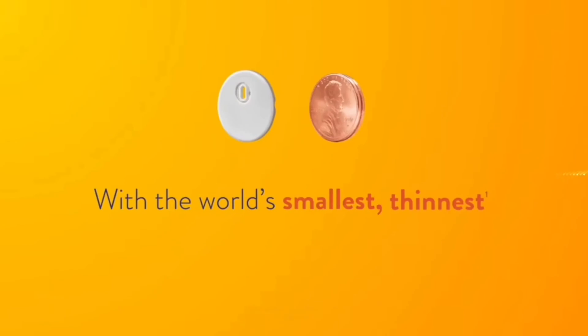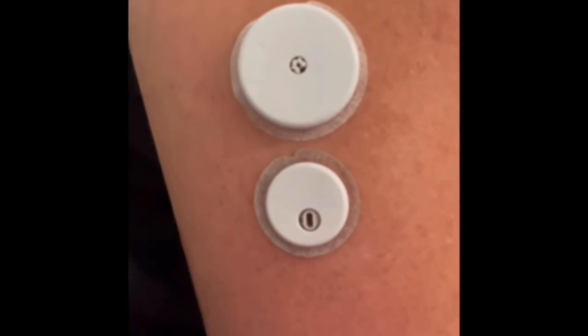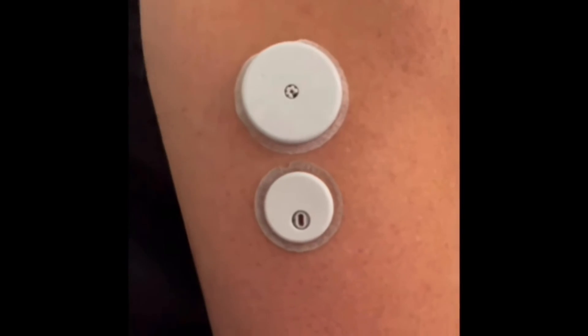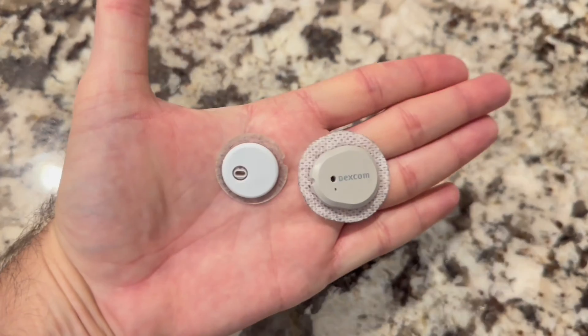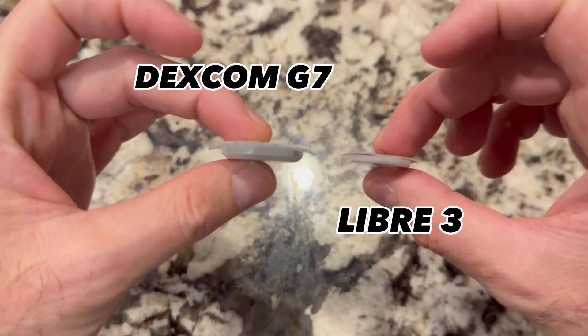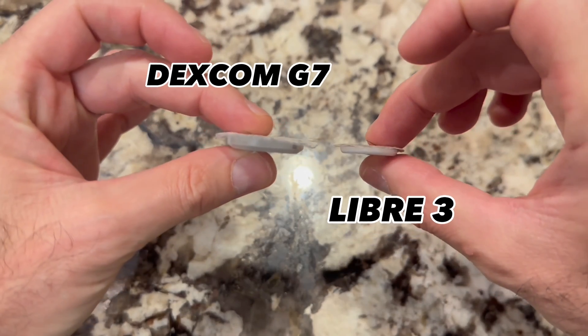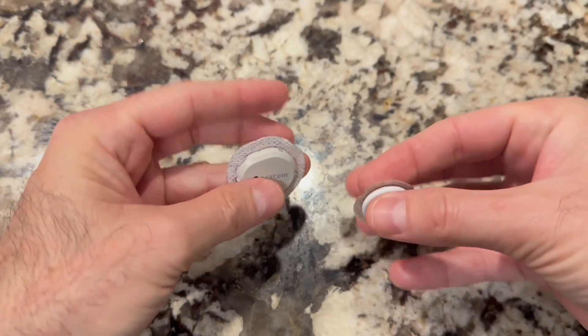Let's talk about size. Both of these sensors are very, very small, and certainly much smaller than their previous models. I did a quick comparison — the Libre 3 next to the Libre 2, the Dexcom G7 next to the Dexcom G6, and then a side-by-side of the Libre 3 next to the G7. While they're both very small, the Libre 3 is a bit smaller than the Dexcom G7. The G7 is just a bit thicker and wider by comparison. That said, whether it's the G7 or the Freestyle Libre 3, they're both so small that after a few hours, I forgot I was even wearing them.